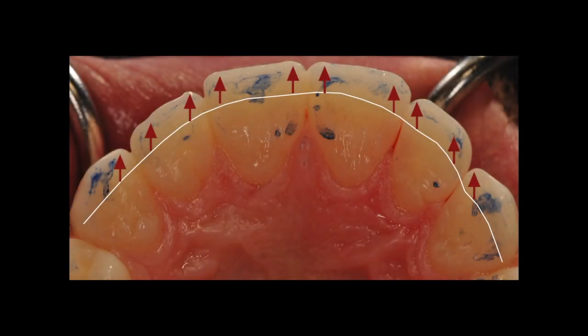This is the lingual view of the completed case, where the red arrows represent the added length to all anterior teeth.